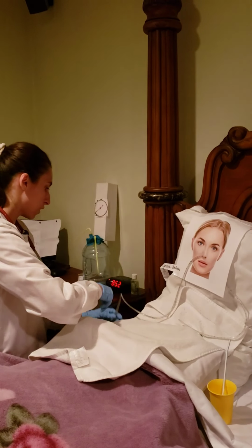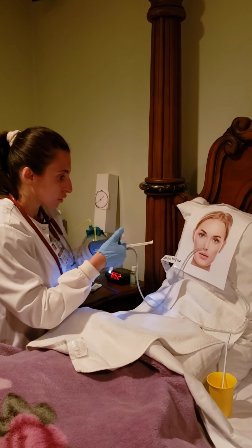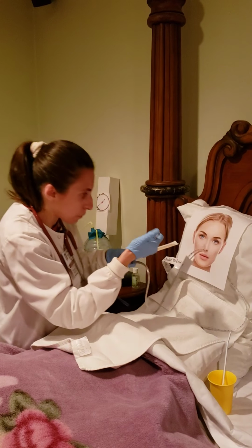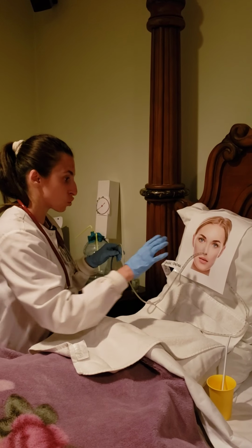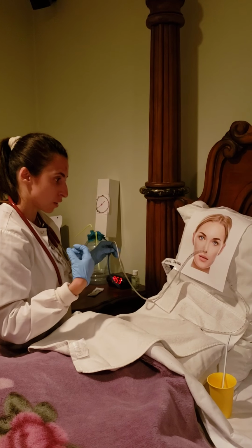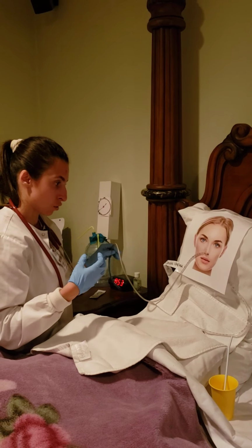Okay, Miss Carmel. I'm going to have you open your mouth for me, please, and say ah. Thank you, Miss Carmel. Just making sure that the tube placement is not jumbled up in the back of your throat. Now I'm going to do a chest x-ray to make sure that there's correct tube placement. A couple minutes later, chest x-ray came back and is in the correct tube placement.